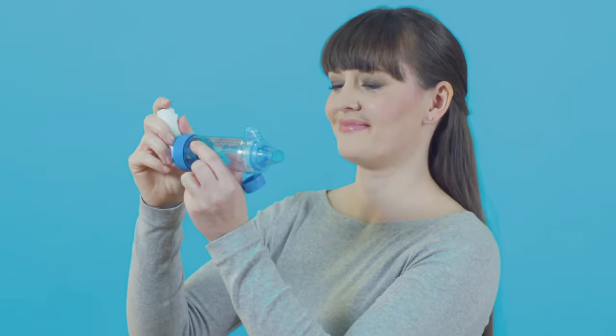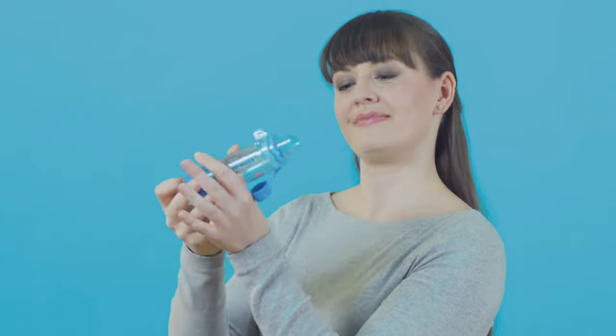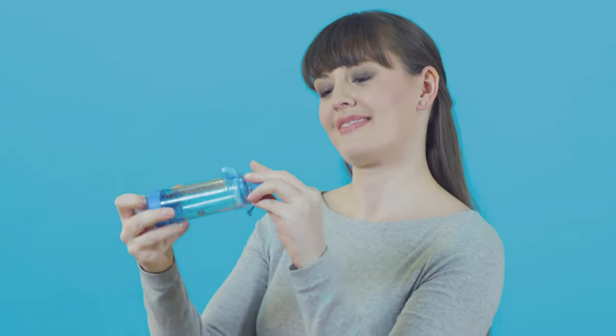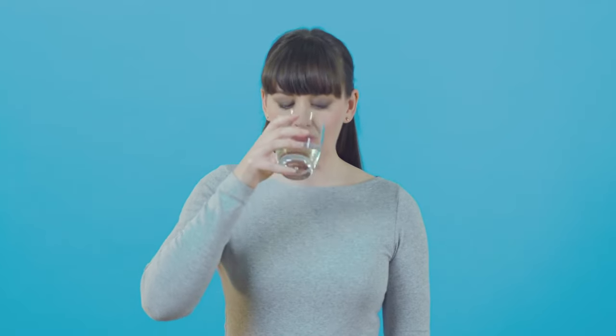When you finish, take the inhaler out of the spacer and replace the caps on both the inhaler and the spacer. If you've used an inhaler that contains steroids, rinse your mouth with water and spit it out to reduce any chance of side effects.